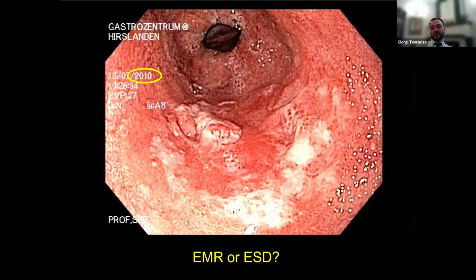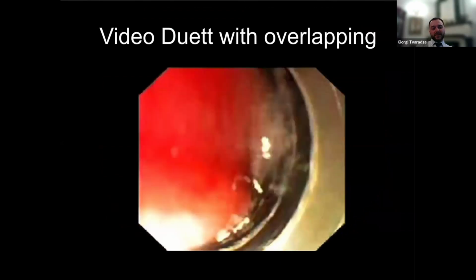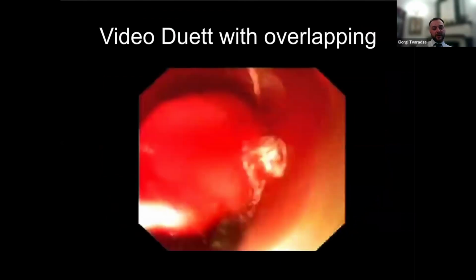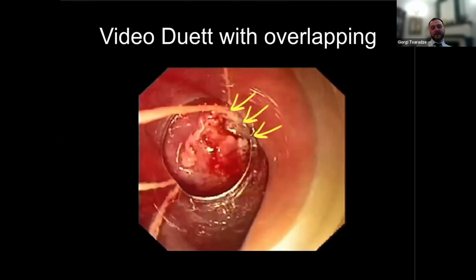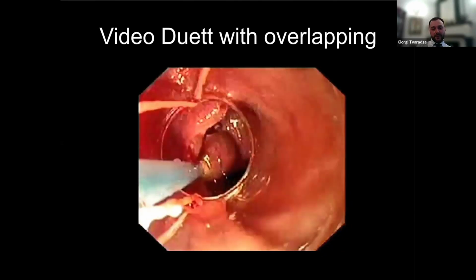We used a ligation device, the Duette set, for the resection. And I want to say that with adequate overlapping, it's possible to have a very good result. To demonstrate it, please watch the following video. This is the principle of adequate overlapping. Now you can see here the cap is always placed in the previous resection area in order to get all the mucosa into the cap. And then we resect it. So this is the principle of adequate overlapping.